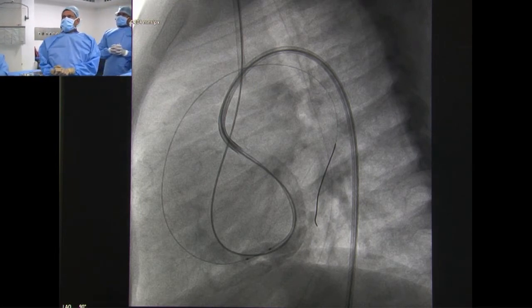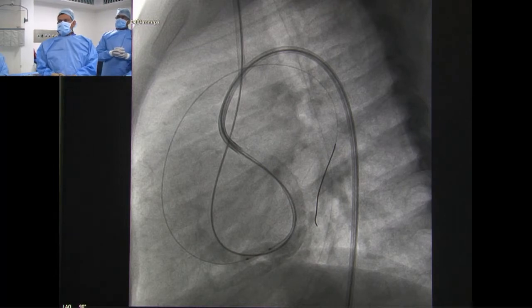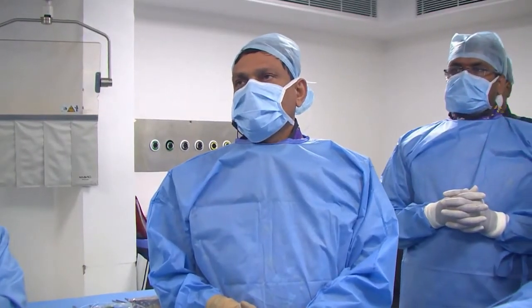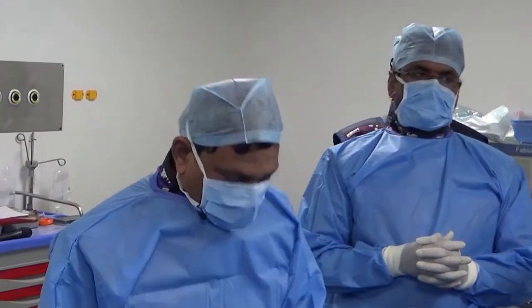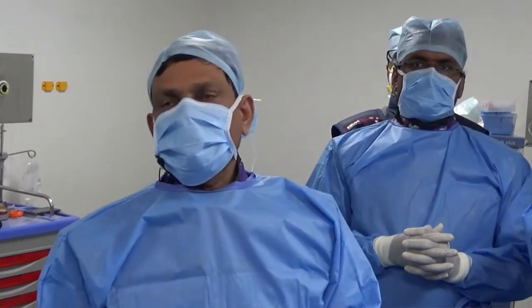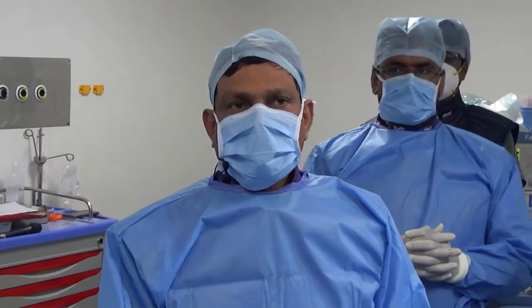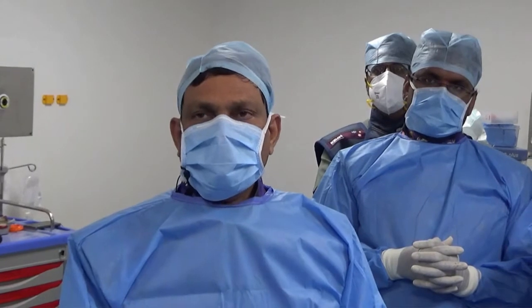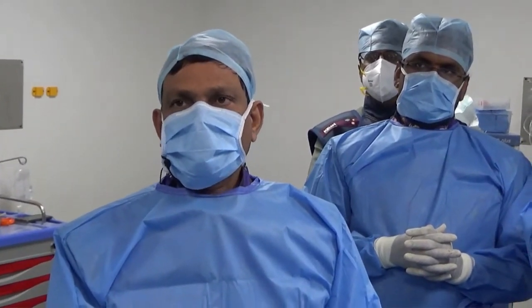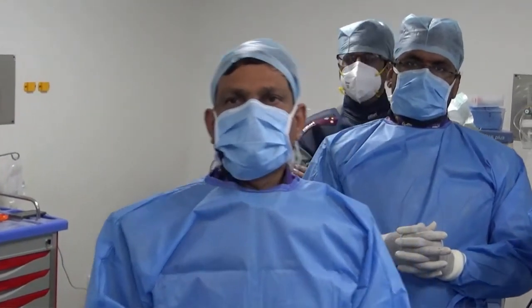Okay, that's fine. So you want to go via the arterial approach or the venous approach? We would prefer the arterial approach at this point of time. We can still go from the venous side. Would you retain the coronary wire while you're doing that, or would you take out everything? That is one of the reasons I kept the 6 guide, sir. If I keep the coronary wire, the 8-6 device will not go, whereas a 7.5 device can go. So I thought we'll keep a 5-6 guide catheter in case of eventuality, buddy wire technique and all. That is the only reason.